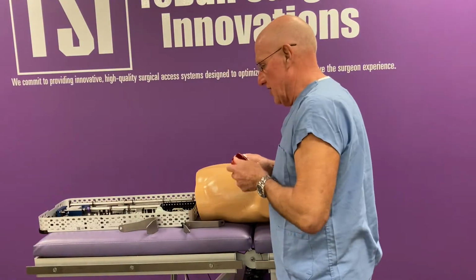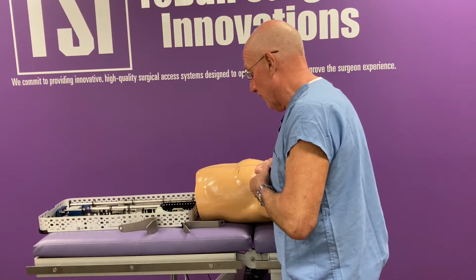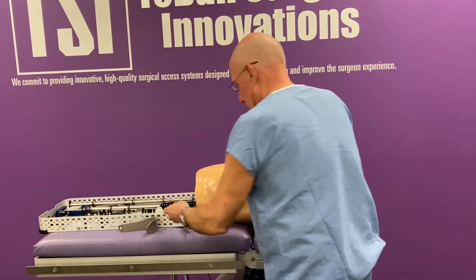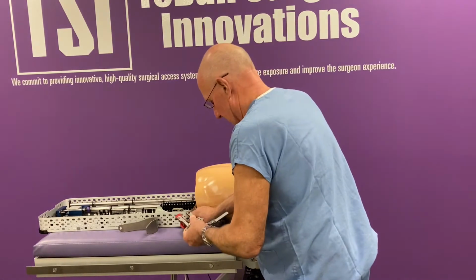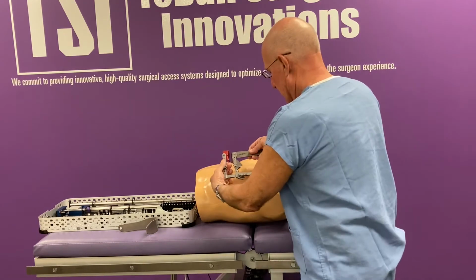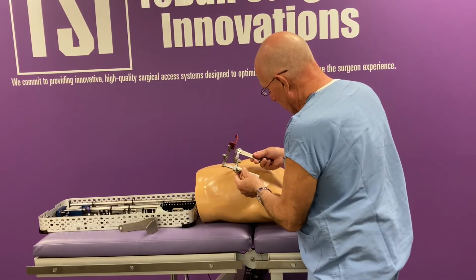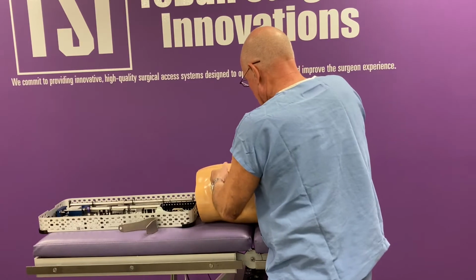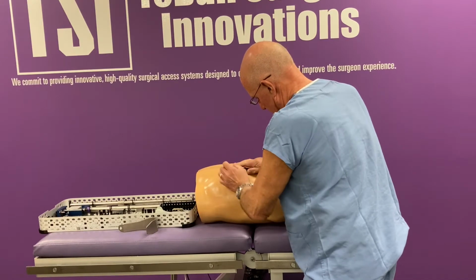So in this application, we're going to use a lower blade and the CT lift blade from the lift set. Put the lower blade here, and then we're going to put the CT lift blade on, the one that we're going to use. And we're going to actually take the standard blade, lift it back so that we can easily deploy the lift blade into the thoracotomy incision. And then we're going to go ahead and put the lower blade into the thoracotomy incision.